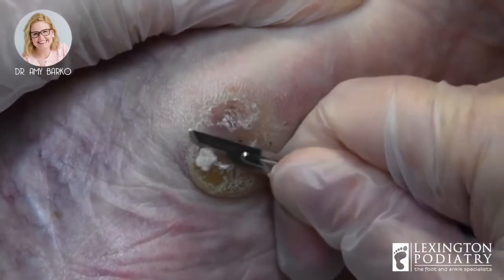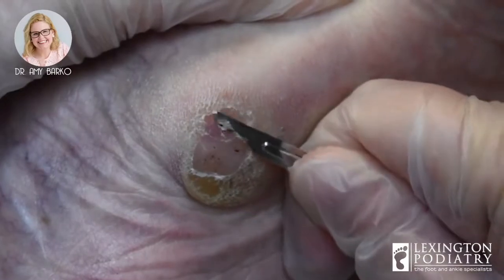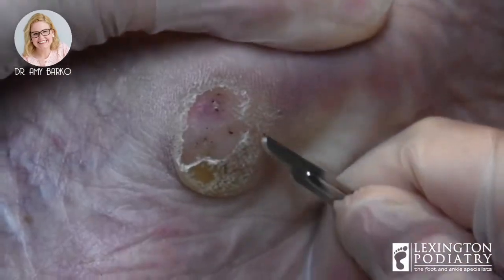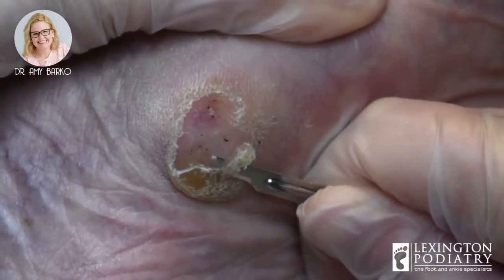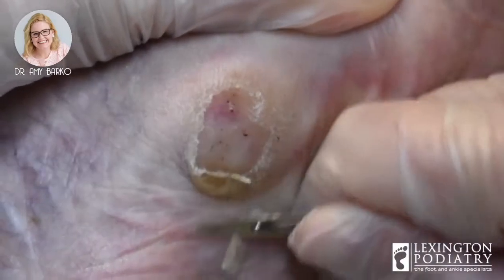And some people will tell you, or even some doctors may say, before you come in, soak your feet. It makes it easier. No, not for me. I just say, come as you are. I want to see what your foot looks like in real life.